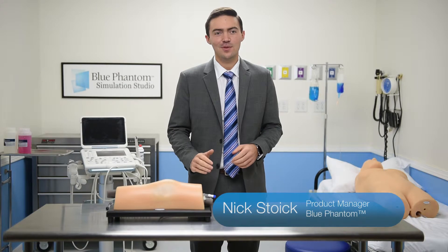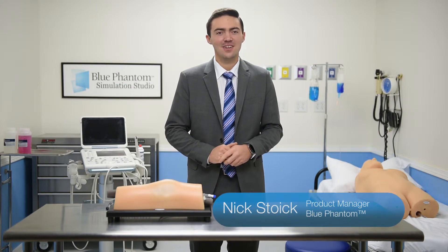At Blue Phantom, our goal is to provide you with the best training tools available, because we know that confidence and capability comes through experience. Having the ability to practice on a model that doesn't get infected or feel pain allows you to develop the skills necessary without the risk.